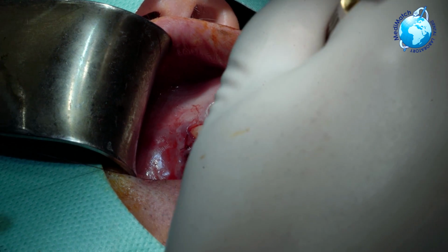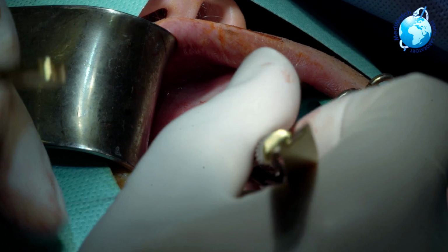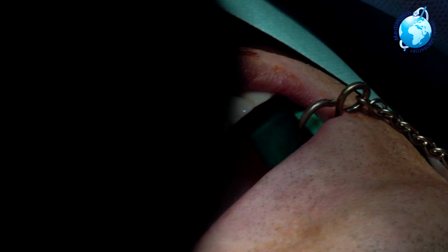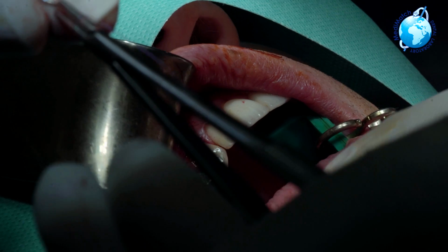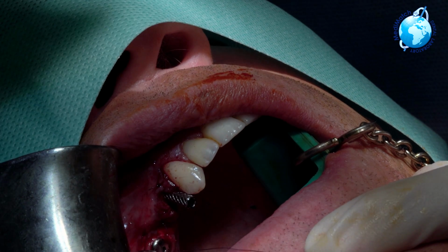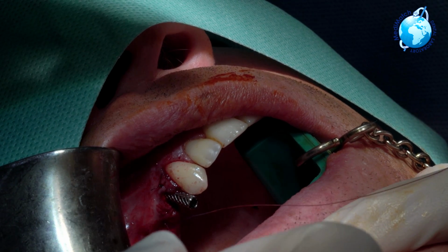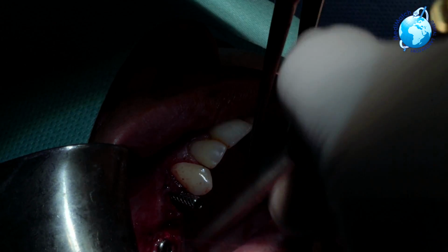Good eye, mate. Yeah? Awesome. Just checking. Maybe one more cross there. Okay, last stitch on this side, Alan, and we're home free. I know, I clocked that.